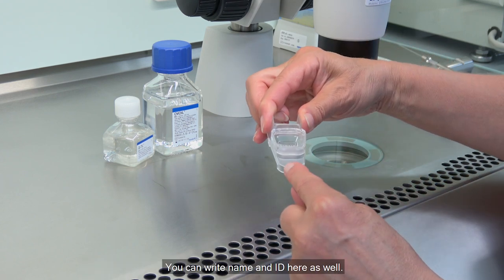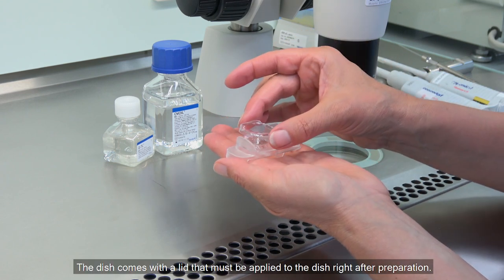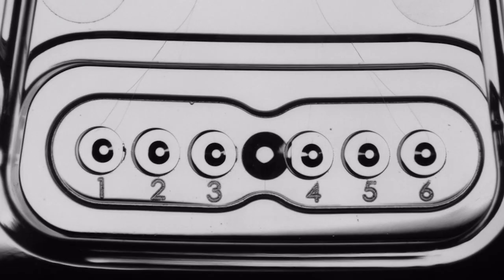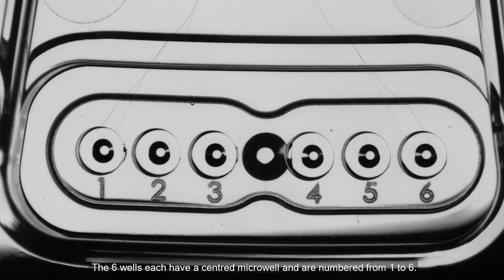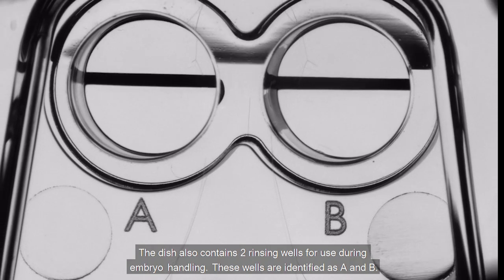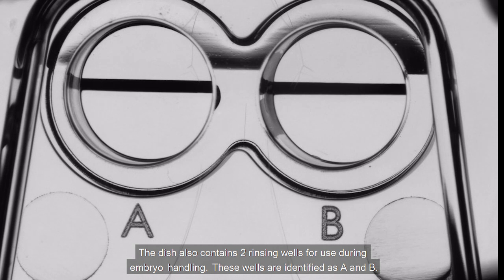You can write name and ID here as well. The dish comes with a lid that must be applied to the dish right after preparation. The dish holds up to six embryos in individual wells. These wells are placed in a shared reservoir for culture under a common medium droplet. The six wells each have a central micro well and are numbered from one to six. The dish also contains two rinsing wells for use during embryo handling, identified as A and B.